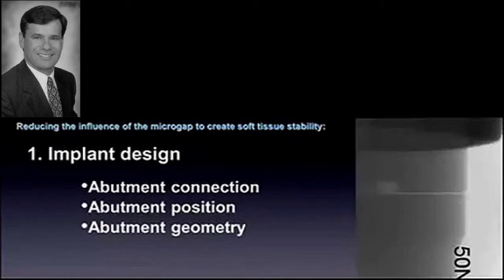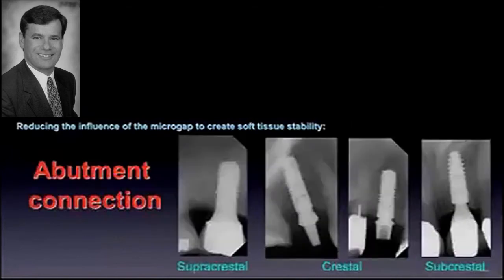And part of it is the fact that, for instance, we have supracrestal designs, Straumann's type of tissue level design, which is a brilliant idea when you think about it. One interface, move the abutment implant connection, or in this case, the crown implant connection, supragingivally, or supracrestally, excuse me, moving it away from the bone and putting it in a position where it's better adapted, and leakages associated with that have a minimal effect.